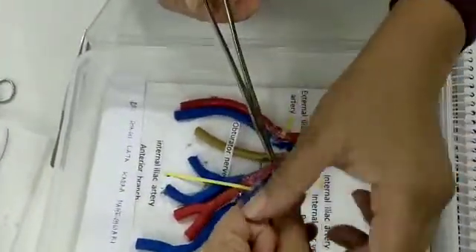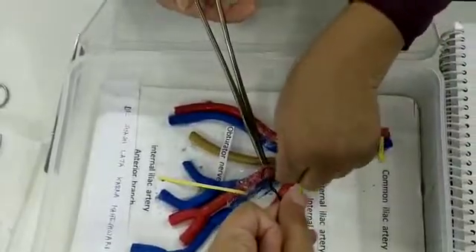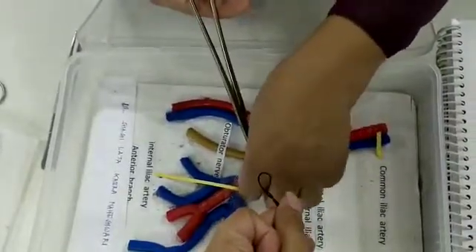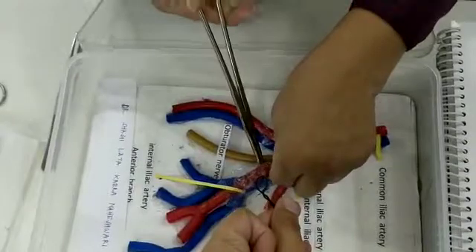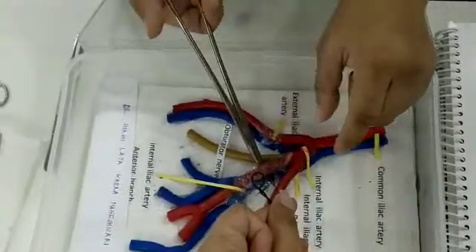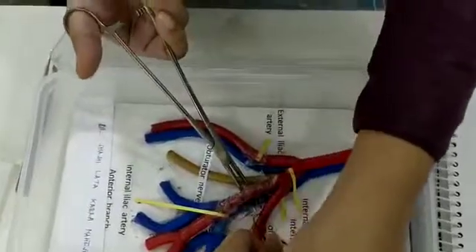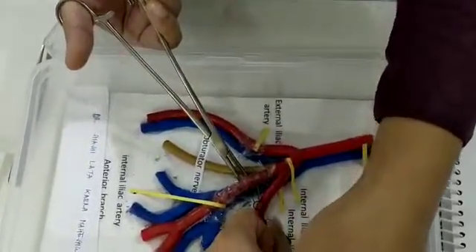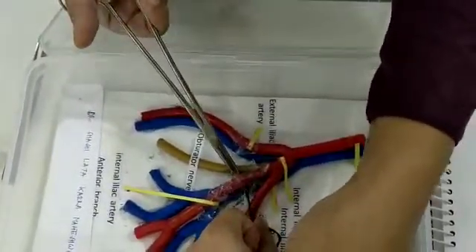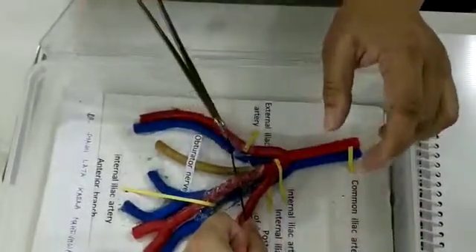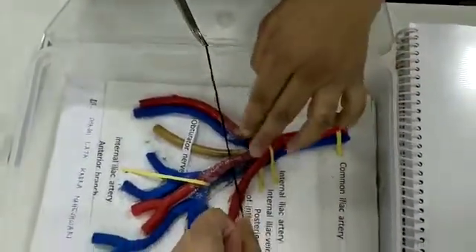Show me the loop. I pass this from lateral to medial direction and take it like this, making a loop.